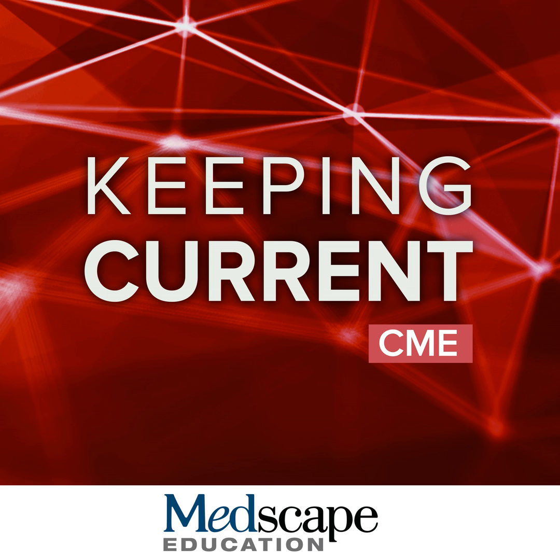Here's another example of ARIA-E, again starting with that pretreatment or baseline T2 FLAIR. Post-dosing, there was a new right parietal sulcal effusion. The patient was followed with MRI again the next month. That right parietal sulcal effusion has improved, but there's a new right frontal effusion. Again, the next month, this has resolved.